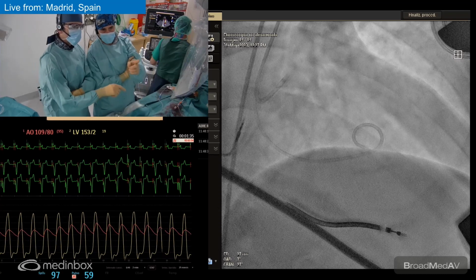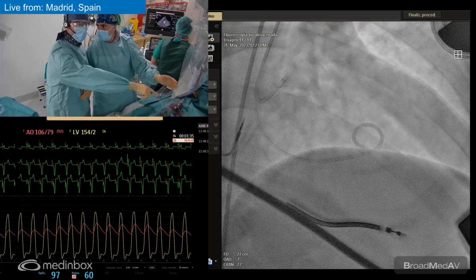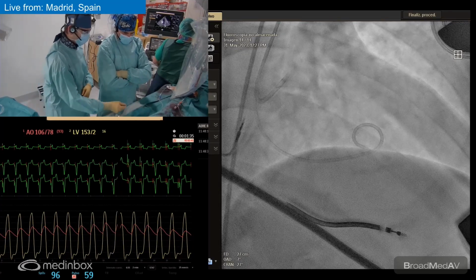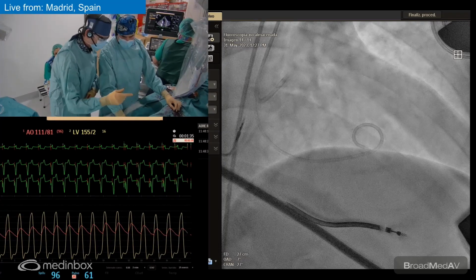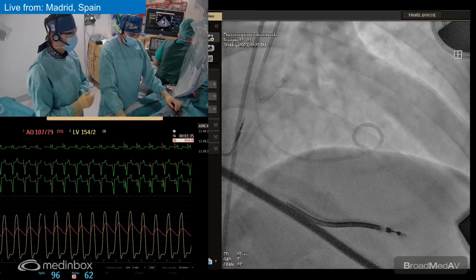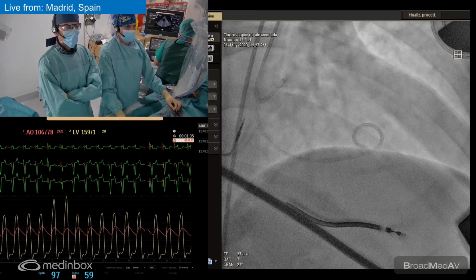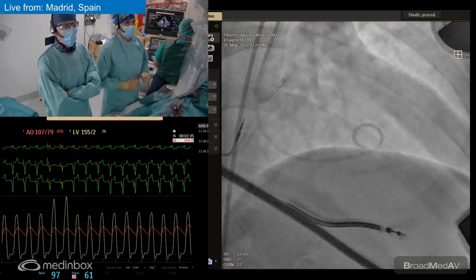So that's the main point. Then, as we said, sometimes the effectiveness of the procedure, depending on the septal anatomy, you can inject if you think it's safe to do it, and expect the best result. But I would say the main point of the echo guidance is to ensure safety in this scenario. Okay. Any other question, Borja? No. Okay, we are waiting. We have to wait just 3 more minutes.